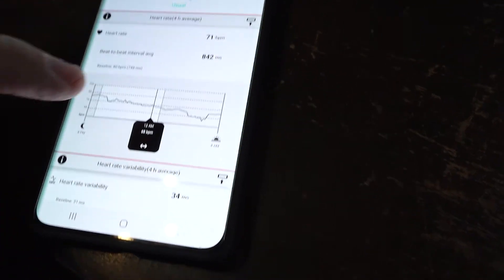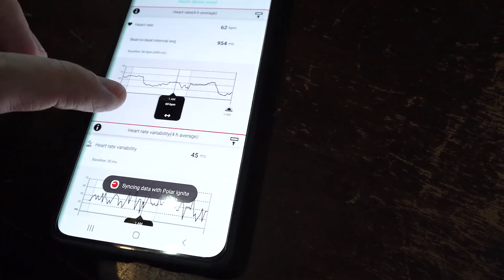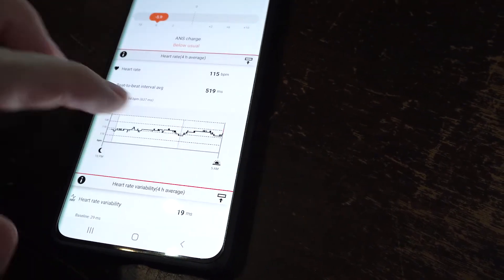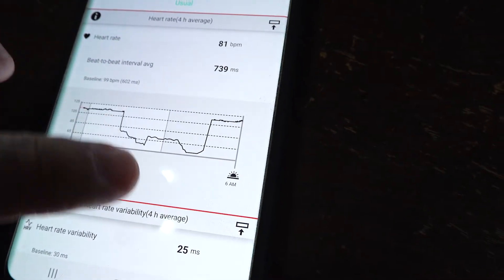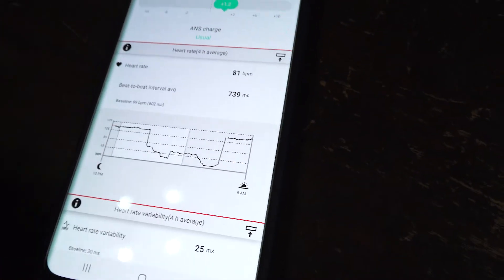From the app I can look at how my sleep was last night — it shows my heart rate, heart rate variability, and breathing rate, and it all looks pretty good. For example, my heart rate was high because it was in tachycardia, but for four hours during the sleep cycle it actually dropped to a good rate, and you can see my breathing rate changed accordingly. Sometimes this watch will say 75 beats per minute, but when I check it with the pulsometer it says 120 — I've had it go the other way too. So it's important to cross-check.